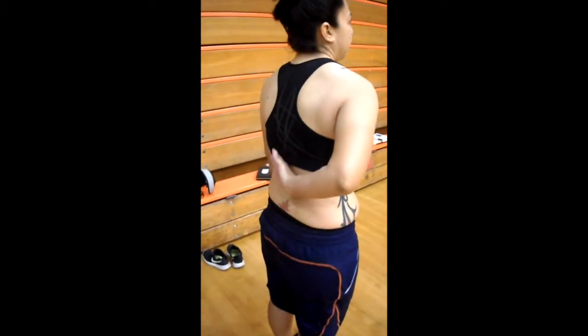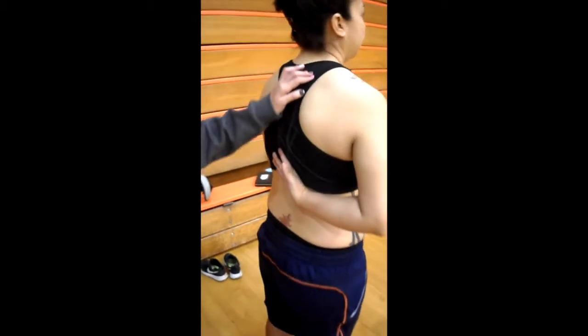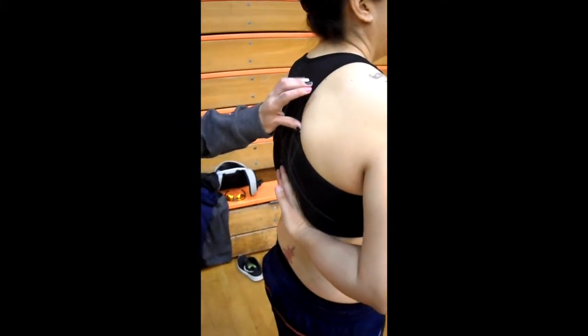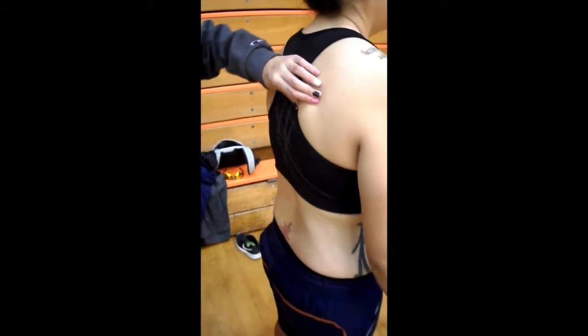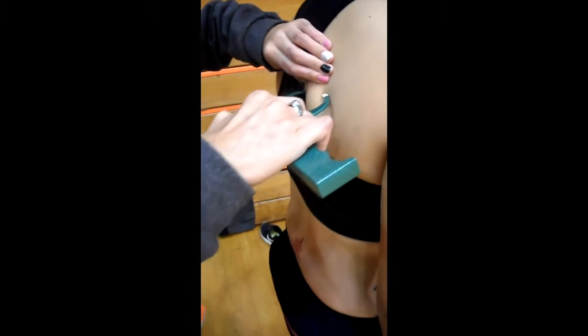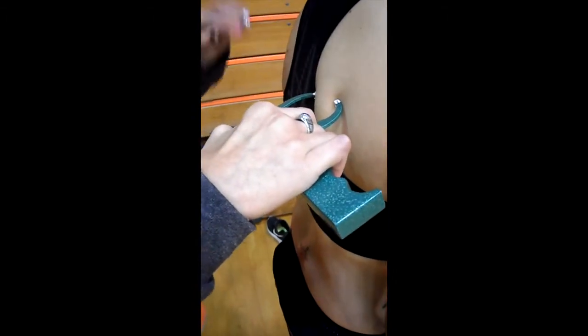The second diagonal fold is the subscapular. This should be taken 1-2 cm below the inferior angle of the scapula. If you have trouble locating the spot, you can have your client reach their arm back until you find it, but then make sure they bring it back down before you take the measurement.